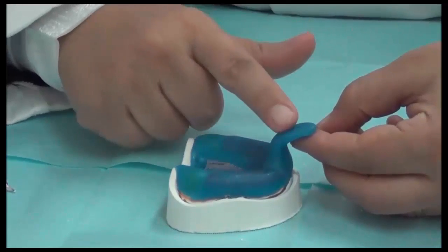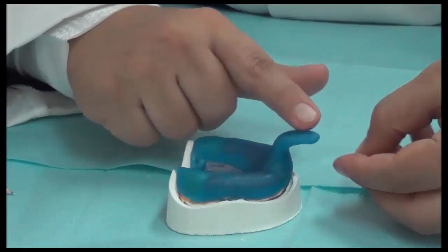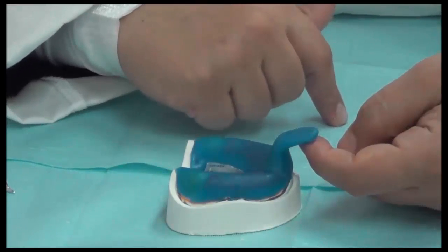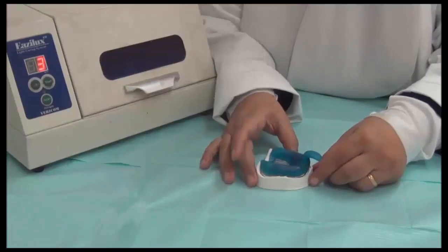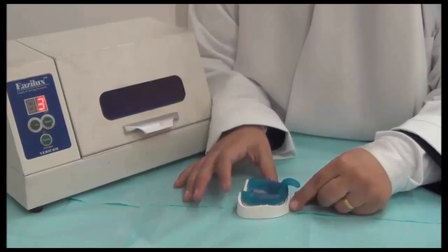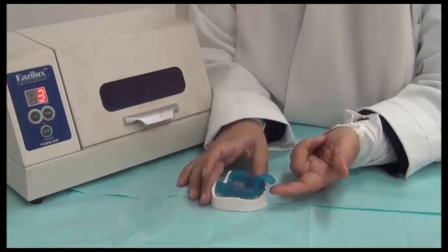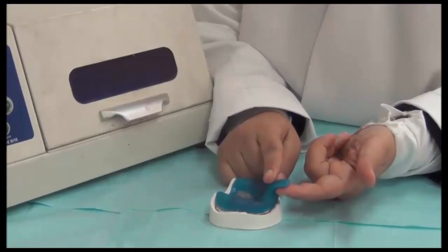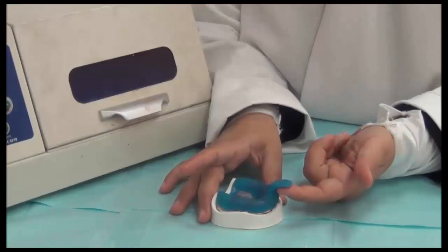Inside the light cure, take in mind that sometimes the light cure material you're using might flow back down. So we might need some support here to be placed inside the light cure. So now we're ready for the light cure. This is what we said about the handle. Sometimes it slumps down. So we need to put it back, and when we put it in the light cure, we're going to support it by something.